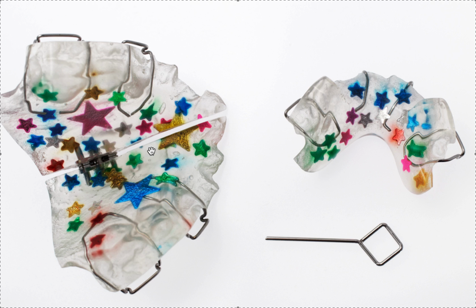It has to be worn 24 hours a day if possible. If they can eat within it, even better. Bare minimum has to be 22. If they only wear it at nighttime, it's not going to work at all. Do not bother. It's not going to do anything. You're wasting your time.